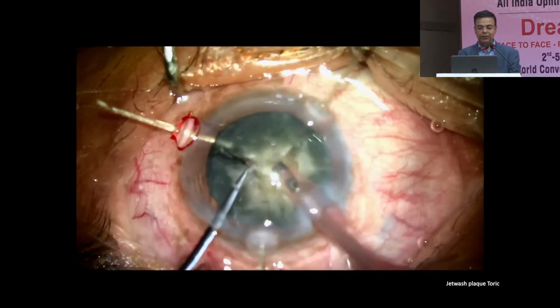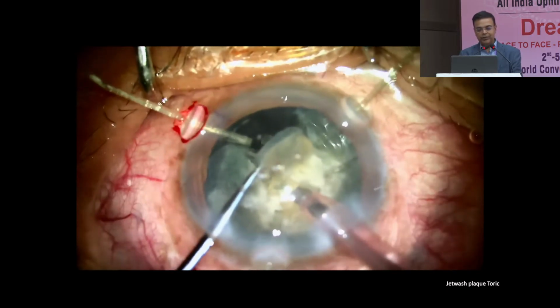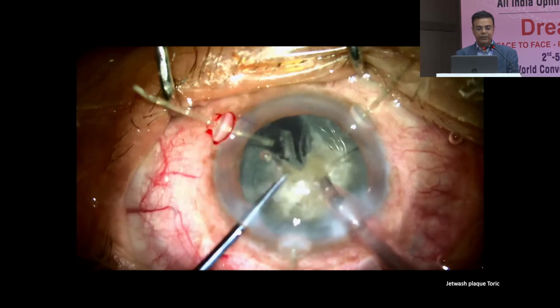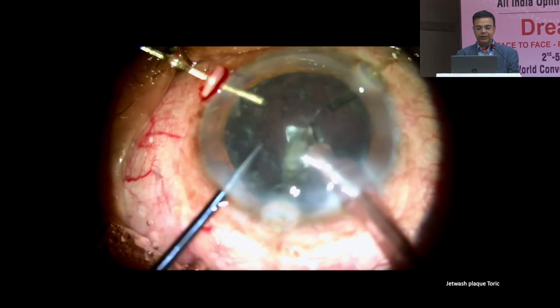There were 3 capsular hooks. They looked like they were enough, and you can see that it's a very hard cataract. The patient had VR surgeries and oil removal, so the capsule was expected to be friable, and as you can see, the bag was very mobile and moving all over the place as we went through with this.